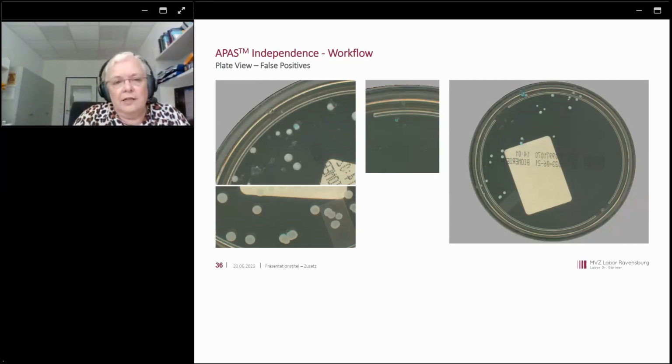Sometimes, okay, I see also it is very, very careful. What it marked positive is a light greenish color on one colony, or on some other colonies, or very, very tiny colonies, or colonies on our green labels, which look a little bit greenish. So all of these it will send as positive, but you can then very quickly see that it's not a real positive.